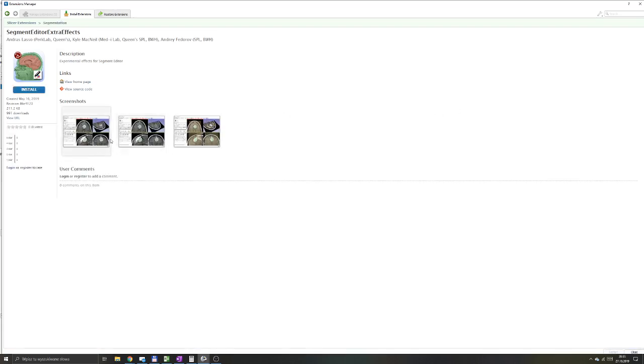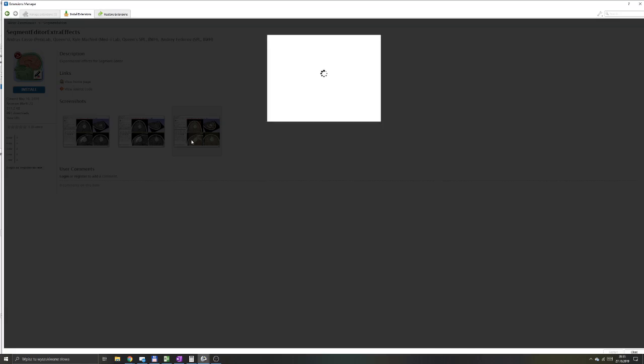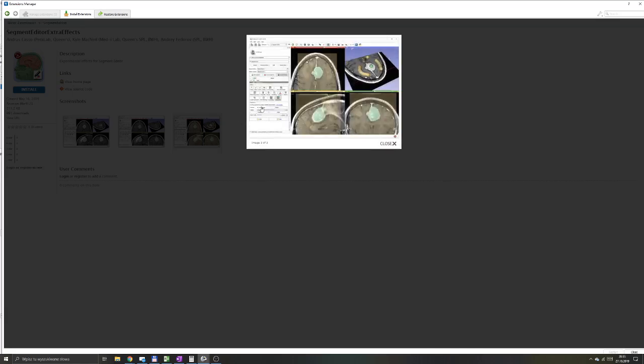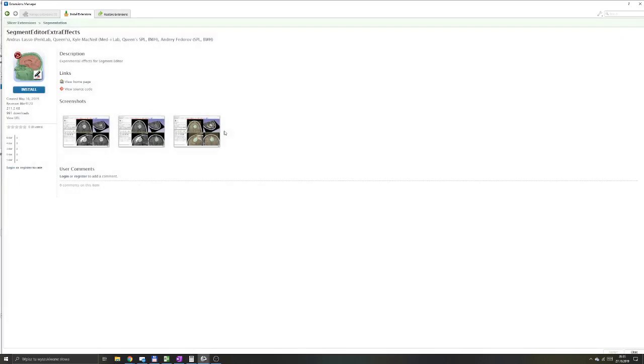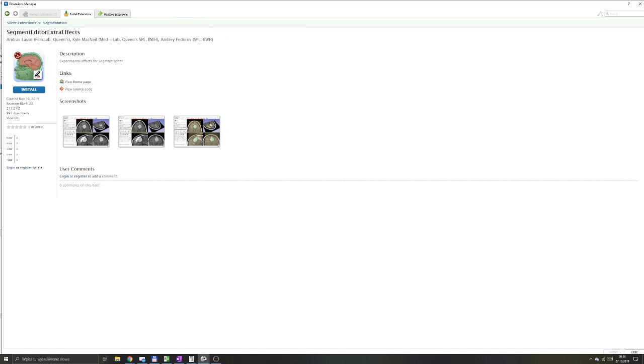It contains algorithms such as fast marching, watershed, flood filling. Those are also not algorithms that are usually used, but you might find them interesting if you're making more advanced segmentations. I'm not going to install them since those are definitely not required and those are interesting only in a very specific application, so we will go back to that later.